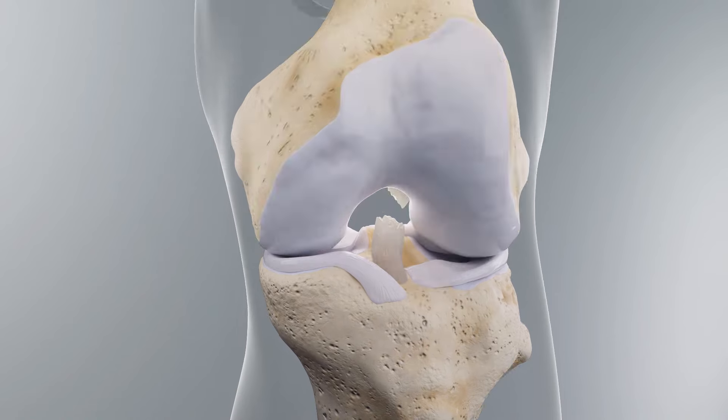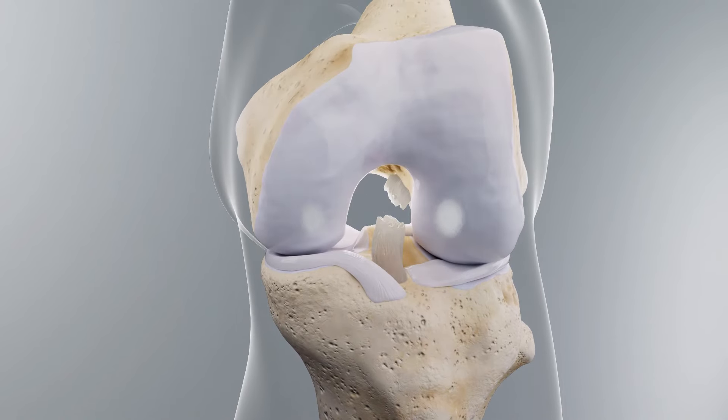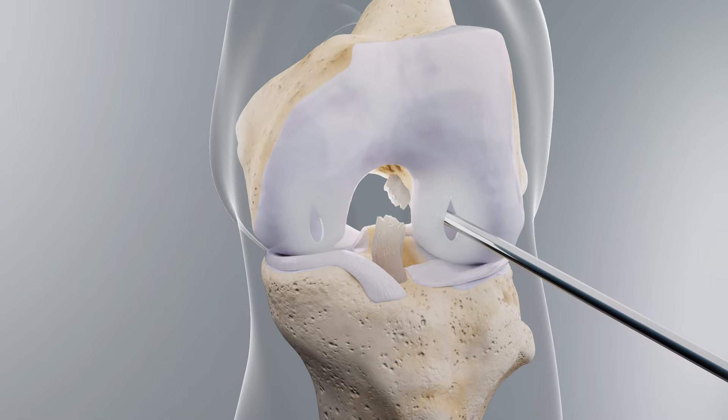With the knee flexed 90 degrees, create standard ACLR viewing and working portals. Perform a medial fat pad resection to achieve adequate visibility of the notch via arthrotomy later in the procedure.